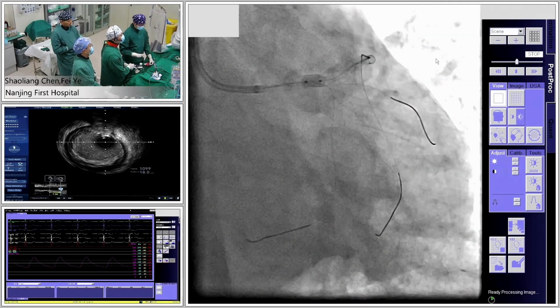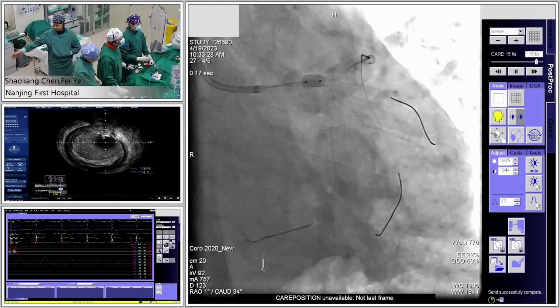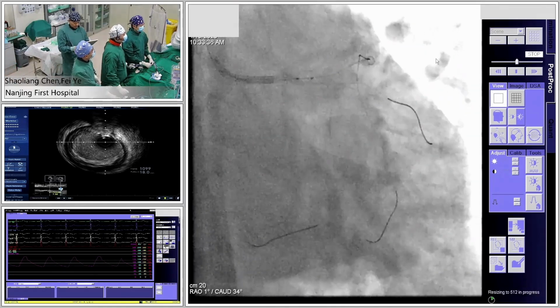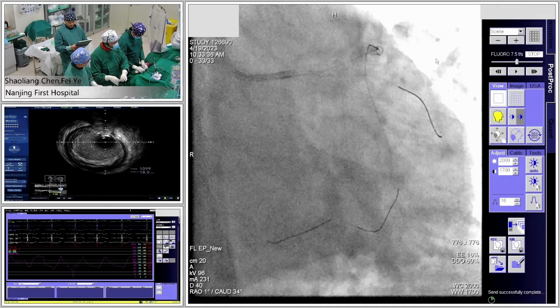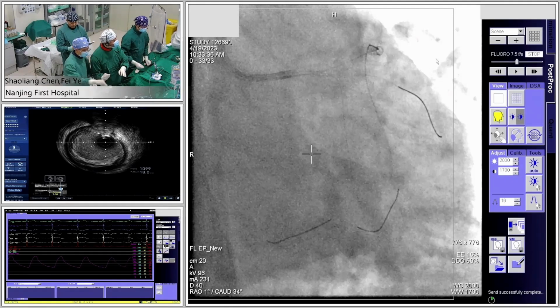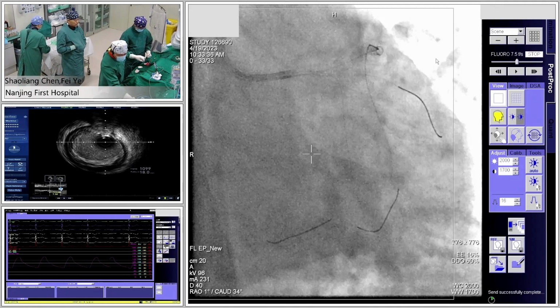Okay, done. It's very important to make sure the POT balloon is fully expanded from the angiogram. From the diameter chart, at 14 atmospheres this 4.5 balloon could increase to 4.55. So it means the increase in diameter is mild. So that's very safe.